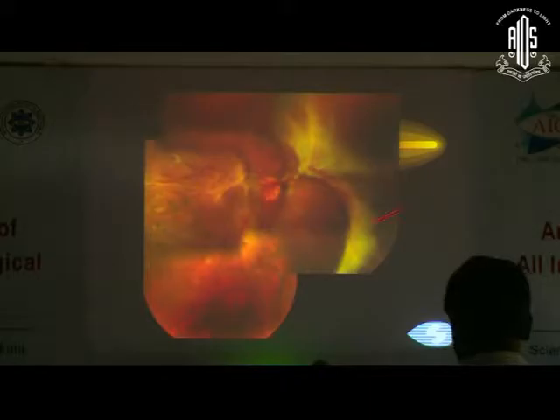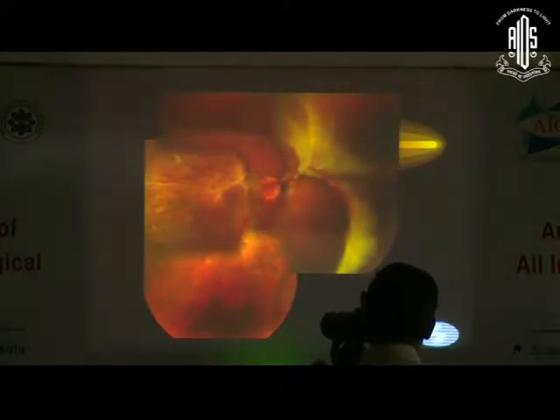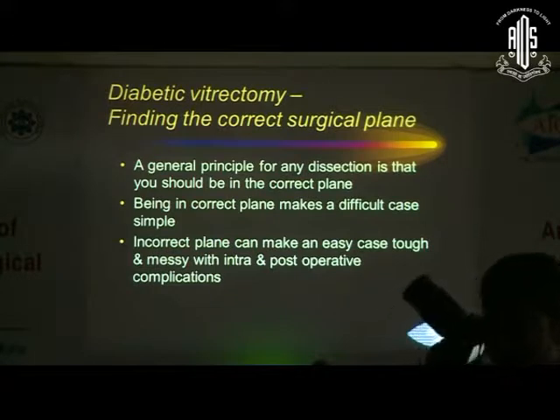Here this has been converted into a combined detachment because of a break which has formed at the base of one of the fibrovascular proliferations, so we can have a combined retinal detachment.